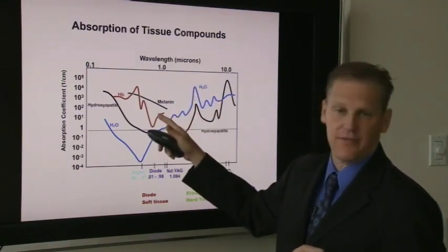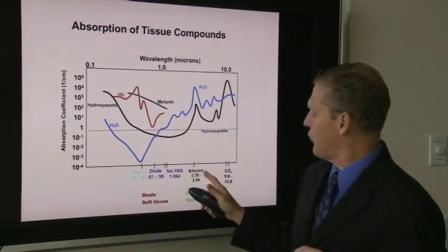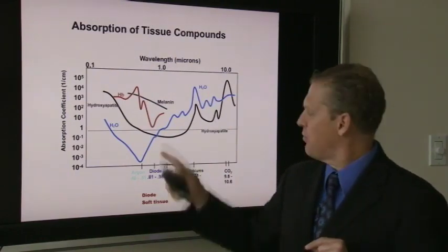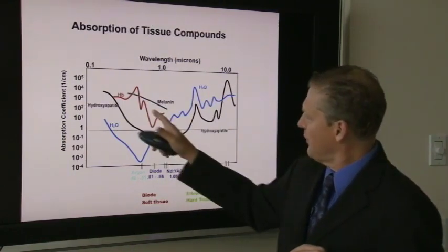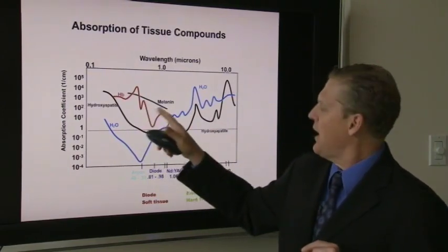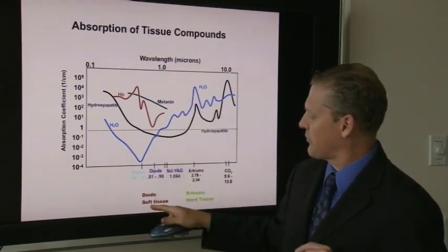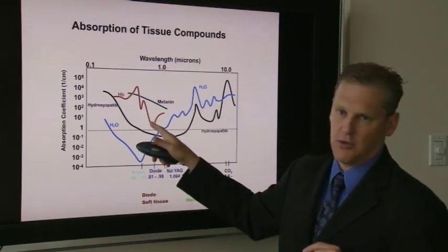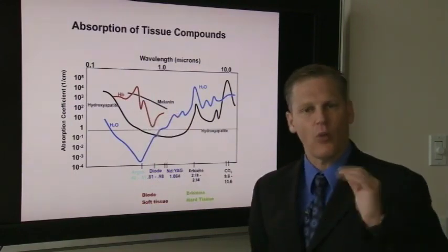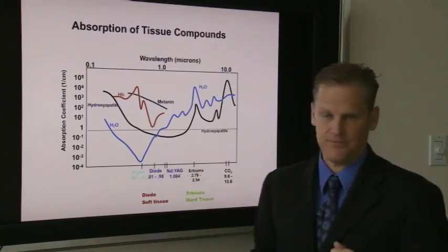Whereas it doesn't have any effect in the hemostasis, so you will find that if you are cutting soft tissue with an erbium laser, you're going to typically get more bleeding. It's important to notice that with erbium lasers, there is no absorption or very little absorption in the hemoglobin. And there is much better absorption in water. Conversely, the diodes, which are soft tissue, are better absorbed in hemoglobin and melanin, and that is why they are much better at coagulating and hemostasis than the erbium lasers.